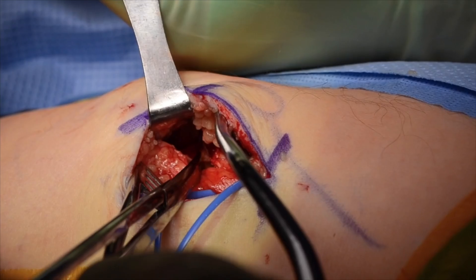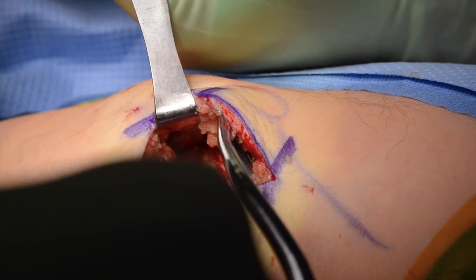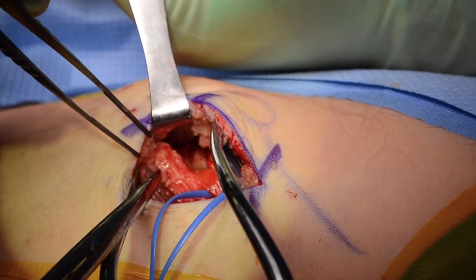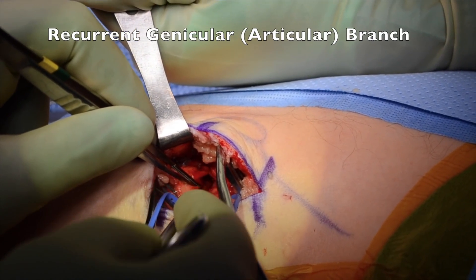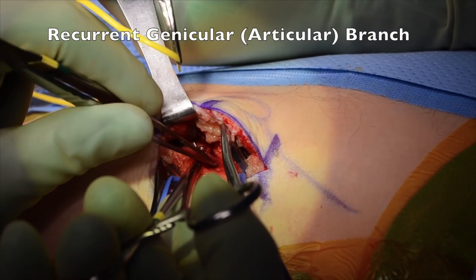This helps prevent bleeding and minimizes pain and morbidity from the procedure. Once this fascia is open, the muscle is retracted and fascia deep to muscle is also opened. The individual branches of the common peroneal nerve are then dissected and isolated.